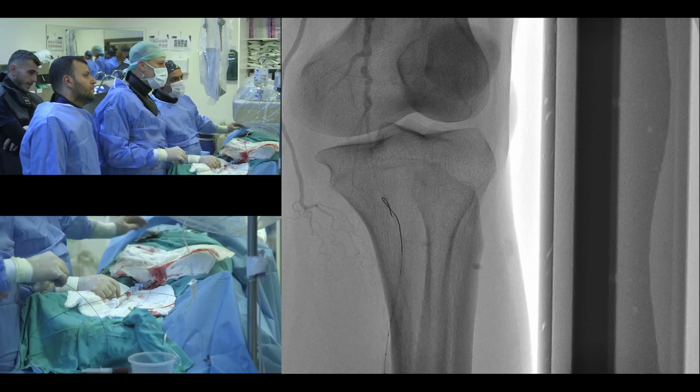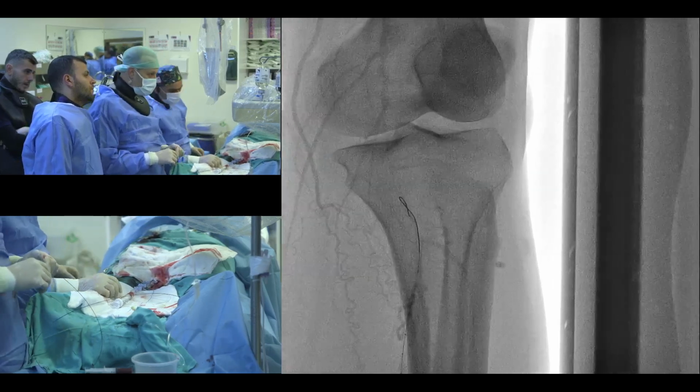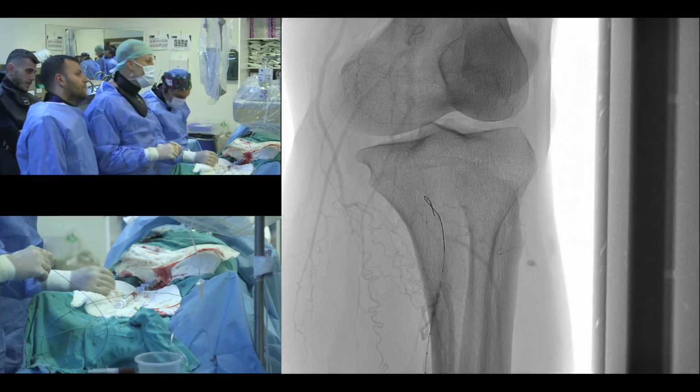Yes, it's coming. Yes. We are here. Yes, we are at this distal cap.